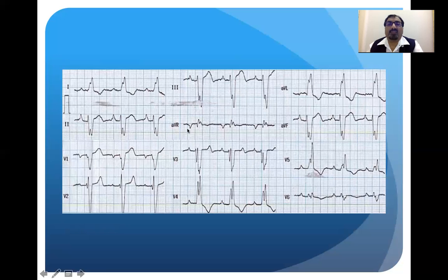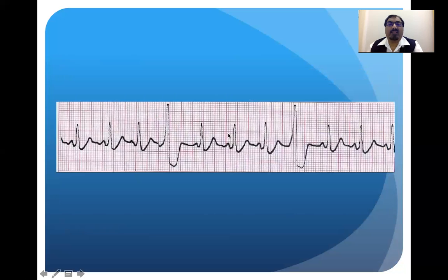That is suggestive of a left bundle branch block. One thing to remember in this particular situation is that all the left bundle branch blocks which are newly occurred LBBB should be considered as acute MI and treated like that. Many times acute MI is masked by LBBB, and therefore we need to look back retrospectively into the old ECGs and then see whether this is a fresh left bundle branch block and then treat accordingly.